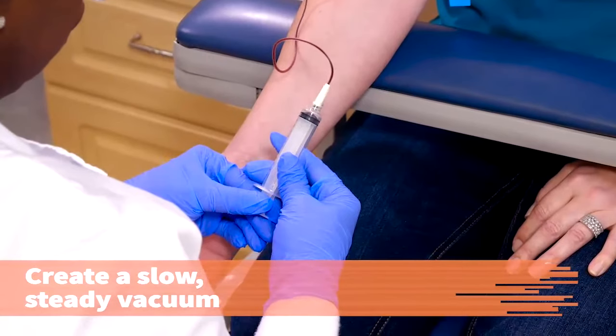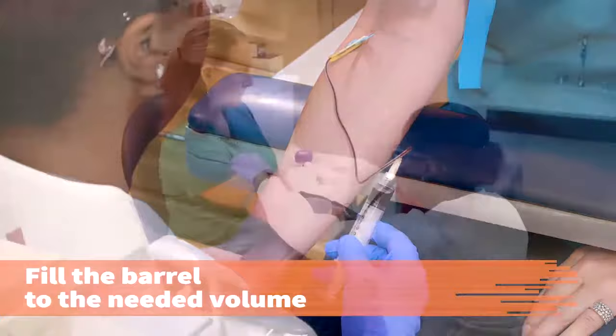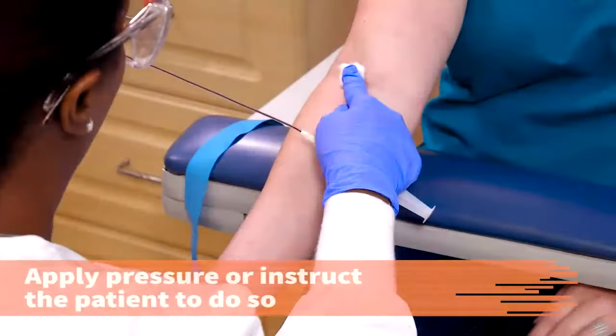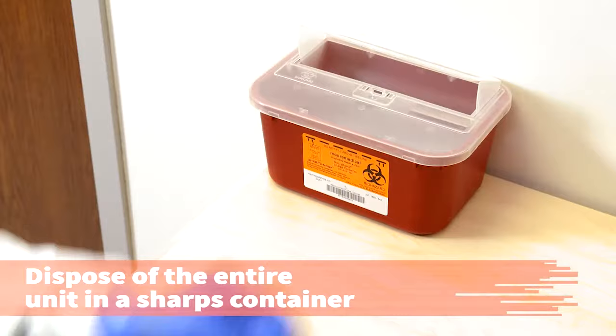Slowly pull back the plunger of the syringe. Make sure the vacuum you create is slow and steady and that no more than one milliliter of headspace exists between the blood and the plunger. Fill the barrel of the syringe to the needed volume. Release the tourniquet. Place a gauze pad or cotton ball over the puncture site and gently remove the needle, engaging the safety device. Apply pressure to the gauze or instruct the patient to do so. The patient may elevate the arm but should not bend the elbow. Dispose of the entire unit in the sharps container.